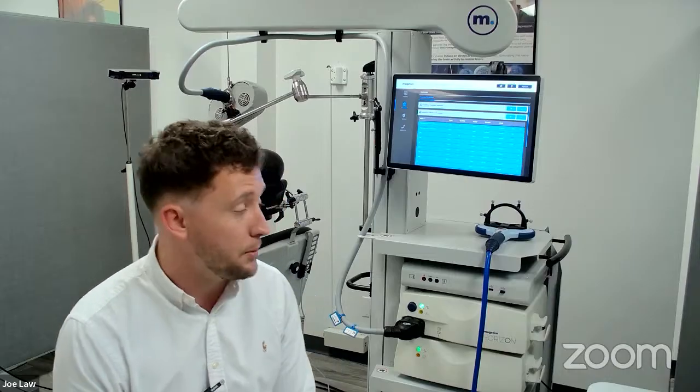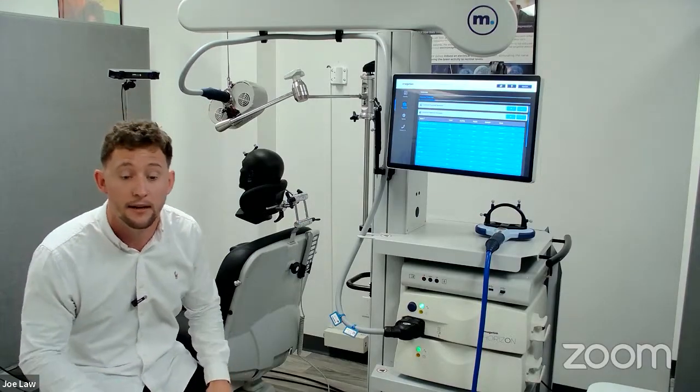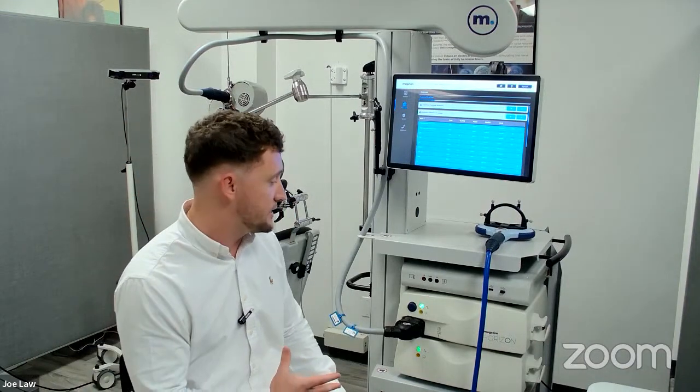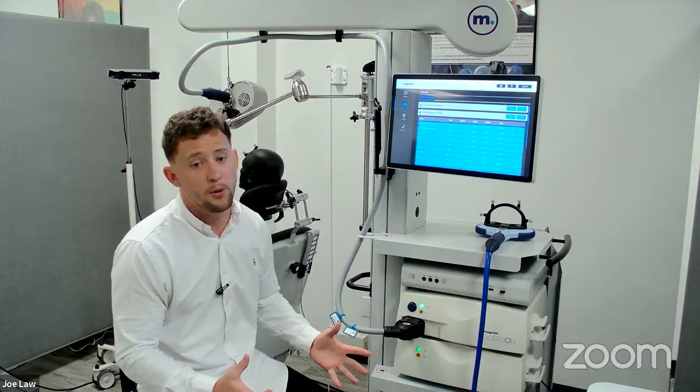And then if, for example, you want to send the coil back after, let's say, 5 years to do a safety test, we can usually turn that around within a couple of days. Again, the beauty of the system is the way we've designed it is everything is very modular. And we've done that purposely.